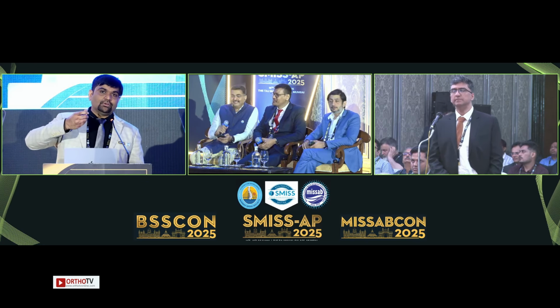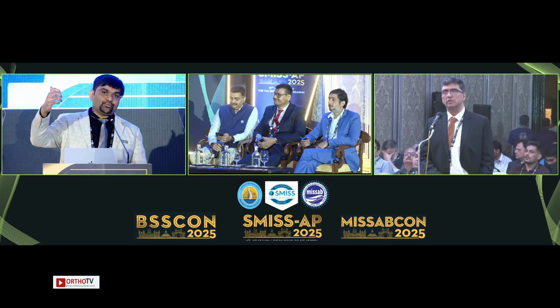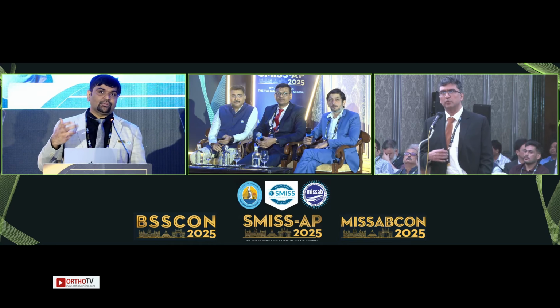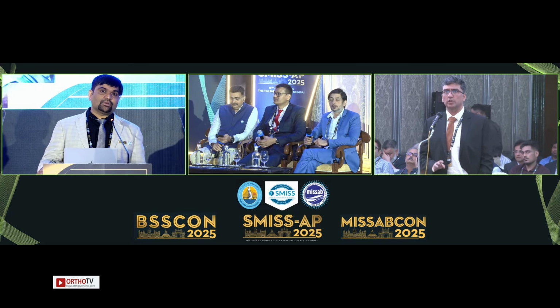But you have to go more medially in a very controlled manner. Once you remove the disc volume, then go medially. Don't push directly, because the thecal sac is very much dorsal here, so it is dangerous. Once you remove a significant amount, then proceed towards the center. How often do you need to convert to open? I have not needed to convert to open.